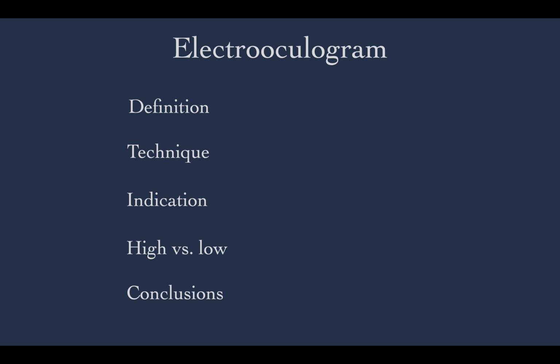In conclusion, in specific circumstances, EOG is a very useful tool in diagnosing hereditary macular diseases. It is often applied in the confirmation of Best disease. Comprehension of disease states that affect the EOG makes it easier to interpret the results. In conjunction with ERG, EOG is a useful test in detecting and following progressive retinal disorders.